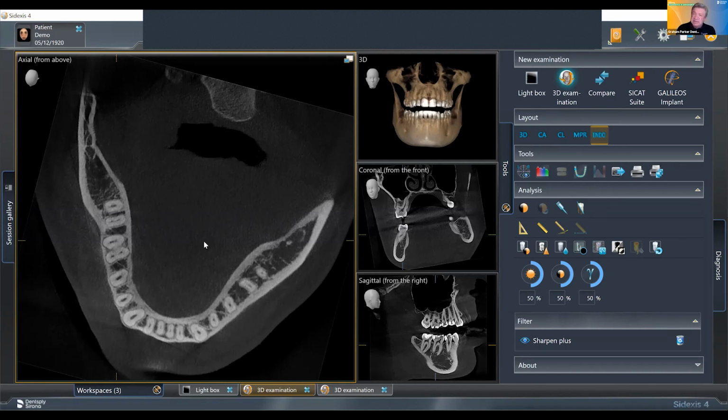I don't know if you ever heard this in your college days, but it's really important that when you're taking a scan, you have all your ducks in a row. You need to justify that you do need to scan, but the technique or position of the patient is paramount when using these machines. If you get the technique wrong, you're going to mess up your imaging. Half the complaints that me and Adam get are because the end user hasn't been trained correctly. So it's really important that you get good training and positioning technique with these units.